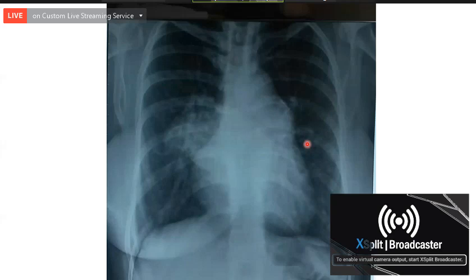So, what is the full diagnosis? Patent ductus arteriosus. The patient has definite X-ray evidence of pulmonary artery hypertension. So you can say the patient has developed severe pulmonary artery hypertension. Eisenmenger. And calcified ductus. The ductus is calcified. So you can see calcified ductus here, prominent pulmonary artery. You can see large pulmonary artery here.